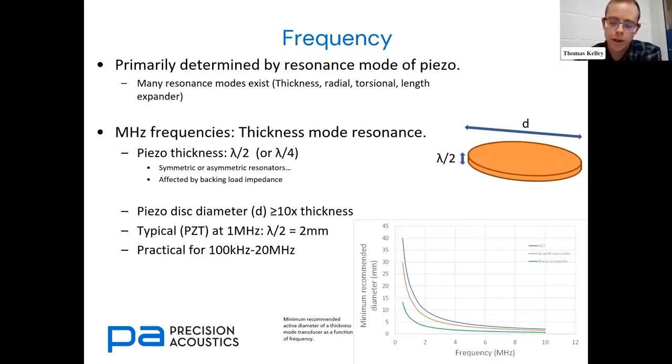Yes, I guess so. You could consider the capacitance of a transducer element to be that of a parallel plate capacitor. So epsilon naught A over D, the A being the area and D the thickness. Piezoceramic elements obviously have an inherent capacitance, but the capacitance in PVDF film is very much greater, owing to the thinness of the PVDF film.